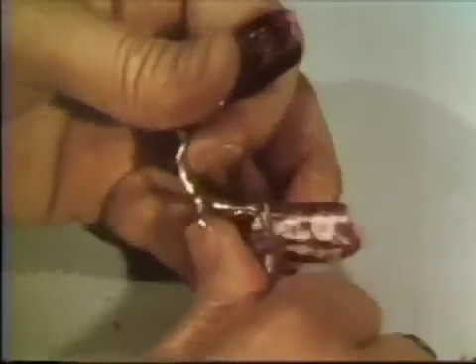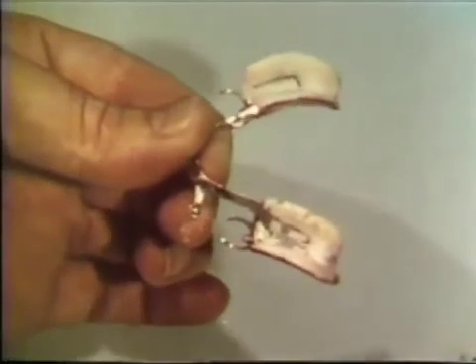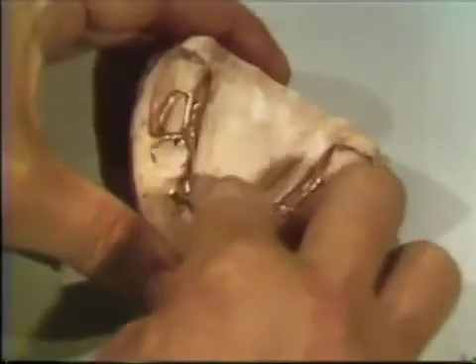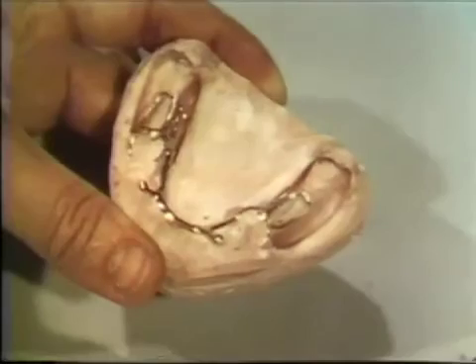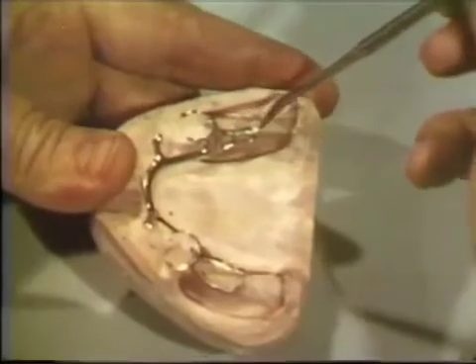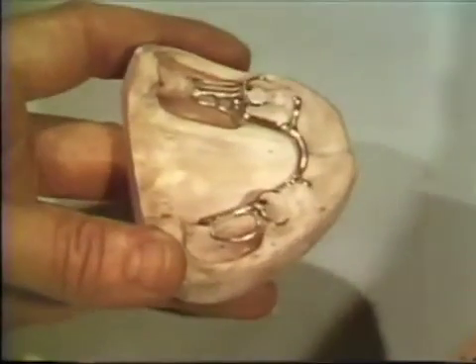The recording wax is now removed and the temporary bases are stripped from the casting. The framework is replaced on the curing cast and attached firmly in position by flowing a hard wax between the ridge contour and the resin retaining units of the appliance. This will act as a base and ensure stability of the framework during the setting of the replacement teeth. Number one Correct wax is suitable for this procedure. The inter-occlusal spacing is again inspected with the framework firmly attached, and the proper tooth selection is made.